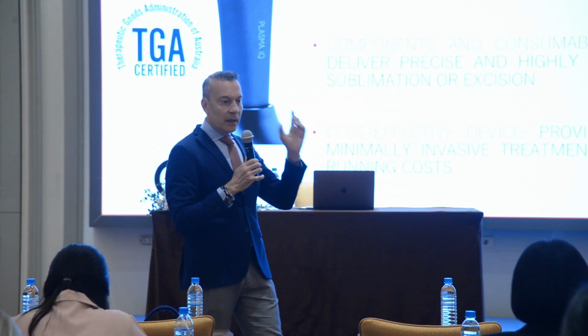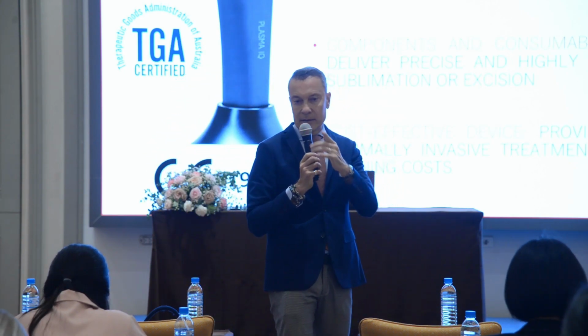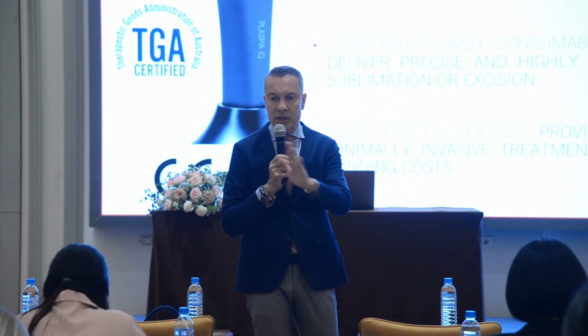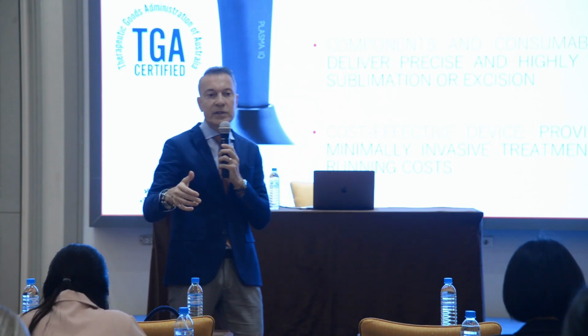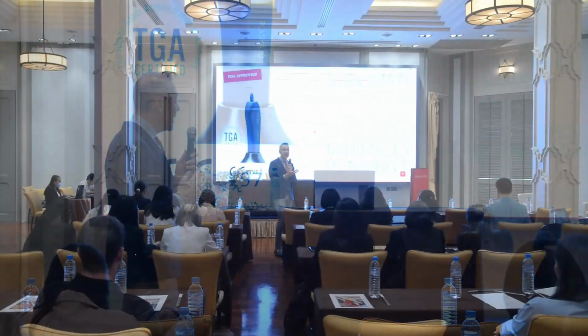The components, the needle, are disposable. We have to change for each patient. Sometimes we have to change it also in the same procedure if the procedure is long.